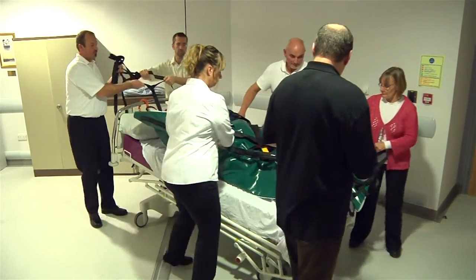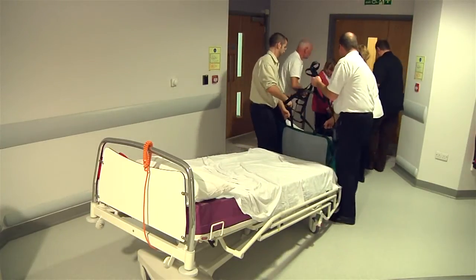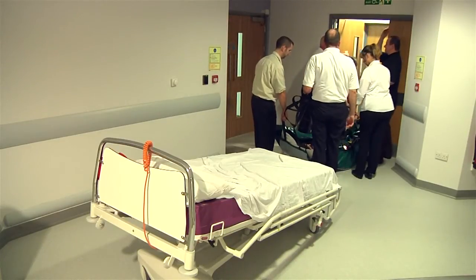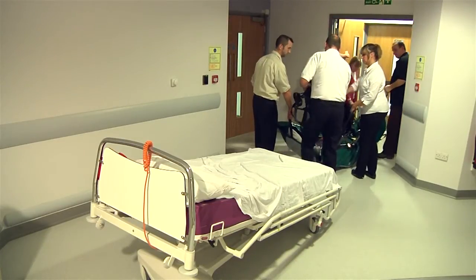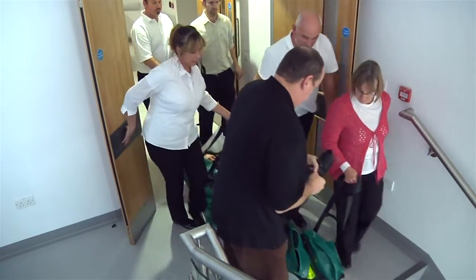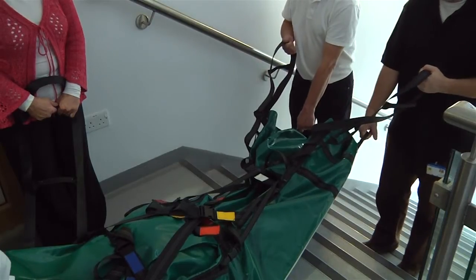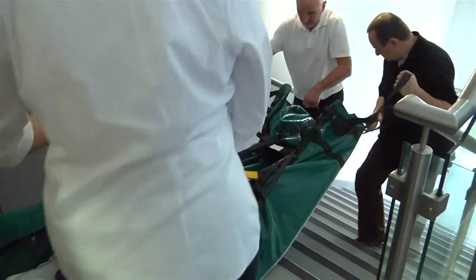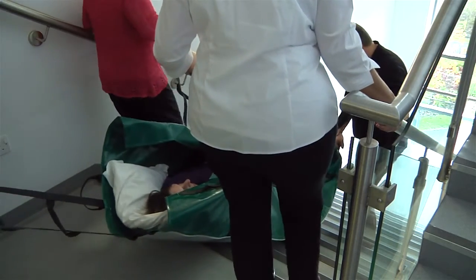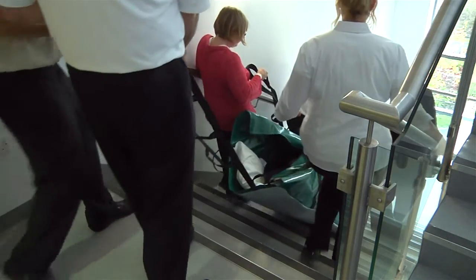Working together, slide the patient off the foot end of the bed. Be sure to protect the head throughout this procedure, particularly as the head comes off the end of the bed. Once the evac mat is on the floor, all available operators should assist in moving the patient towards the stairs. It is vital that the patient approaches the stairs feet first, so be careful to ensure that turning the evac mat around in a narrow corridor is not required. With operators distributing the weight between them, slide the patient down the stairs feet first in a controlled manner.